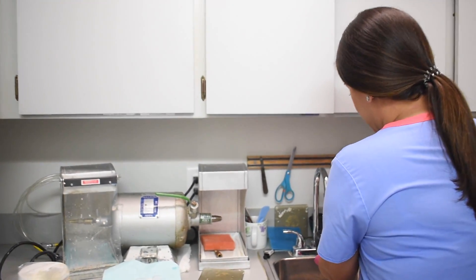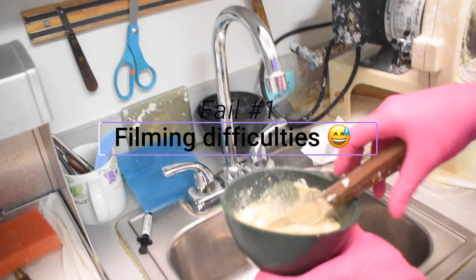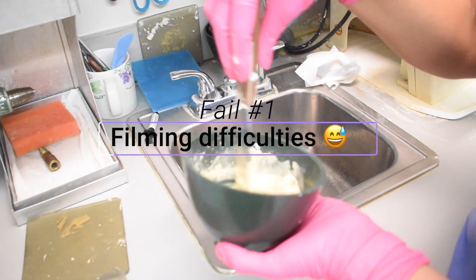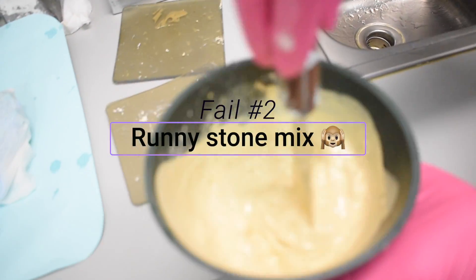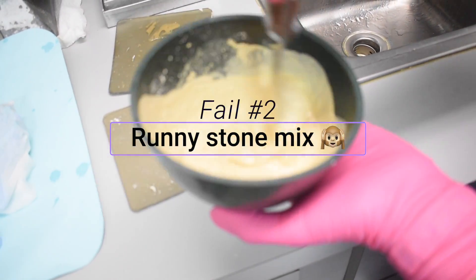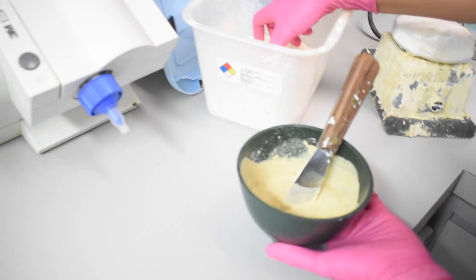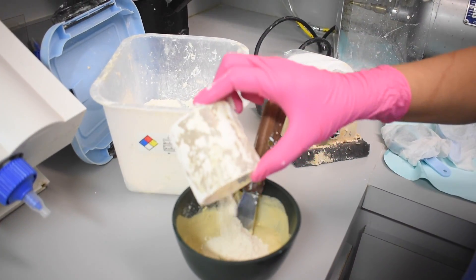Consistency is key when you're mixing the stone. See what I just did? This is a no-no — that's way, way runny. I got distracted because I was talking. Let me add some more. I need to refill the stone here.